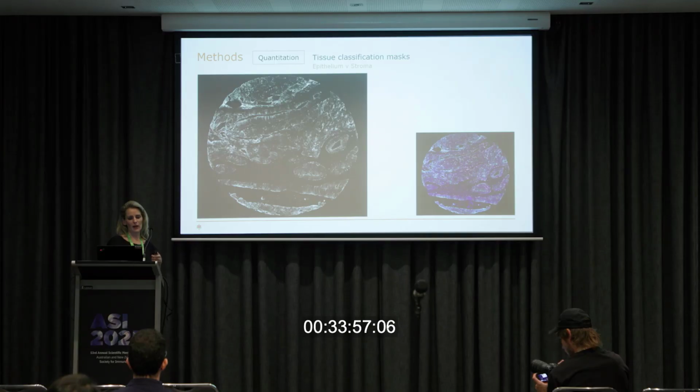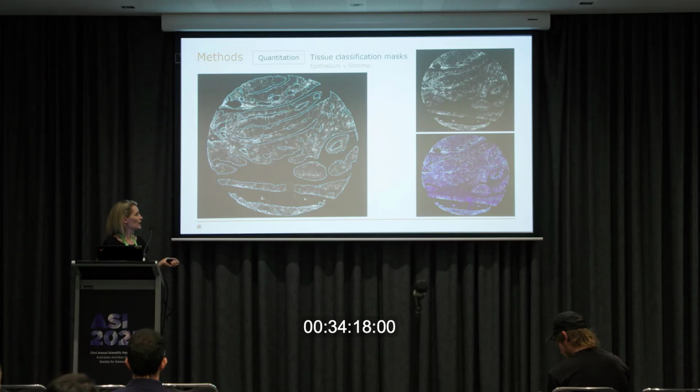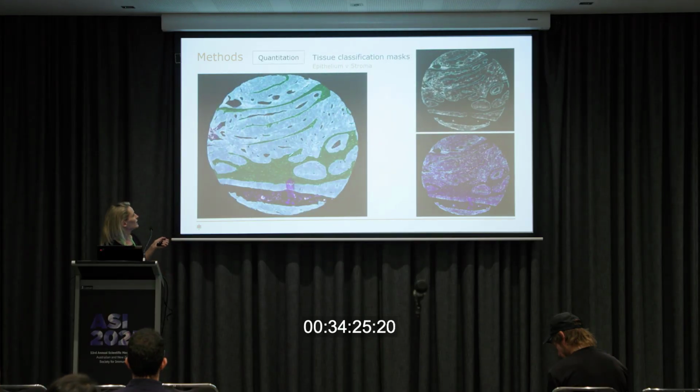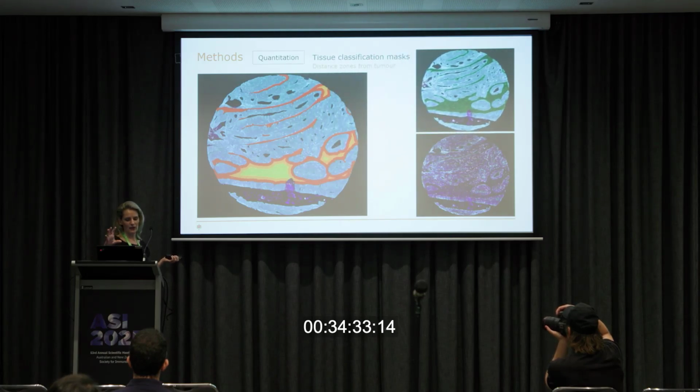The next thing we want is our epithelial mask. Now, there is a classifier in the software. It's pretty good at pattern recognition now, as a pathologist I would do to determine the tumour versus stroma. But because we've already had this process working and we have these profiles already existing, I've just stuck with what we've been doing, which is to use cytokeratin, a pan-cytokeratin marker, to identify epithelium. We then do a threshold and detect on that, clean up that mask, and we create this epithelium mask. So here in turquoise is our tumour, and anything that is green is in the stroma. And as I said, we can measure the areas of those.